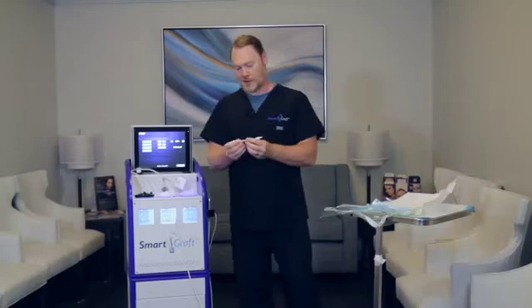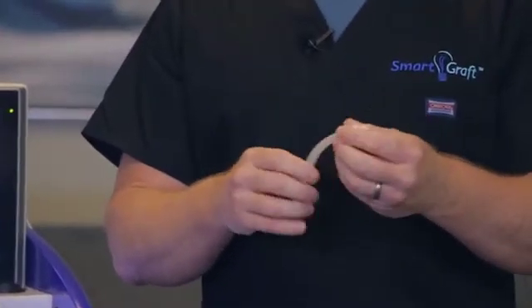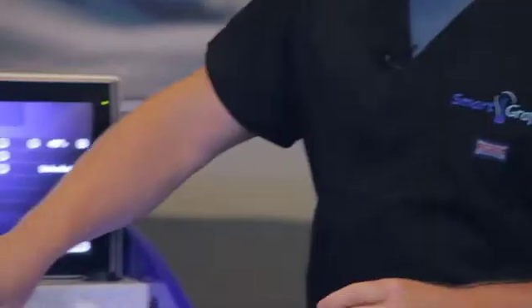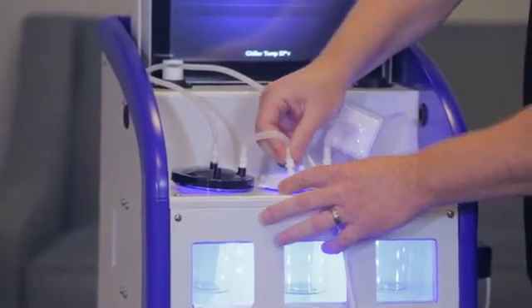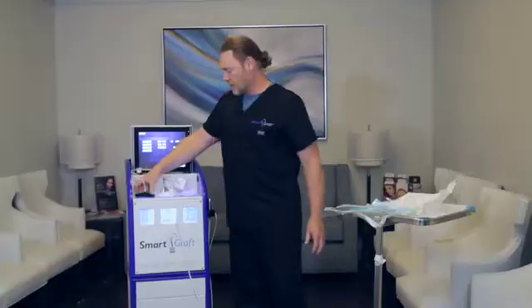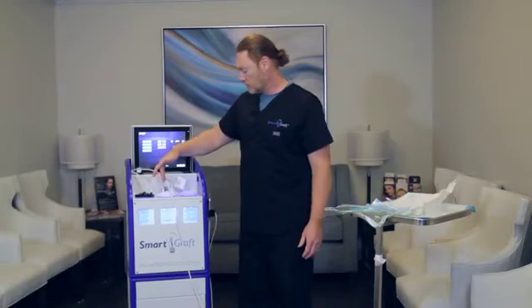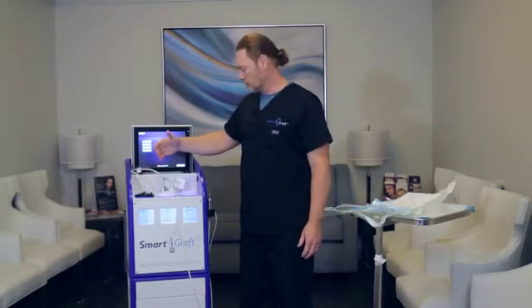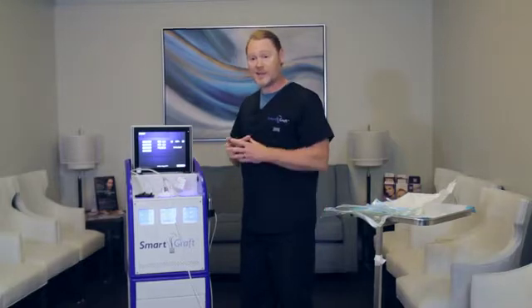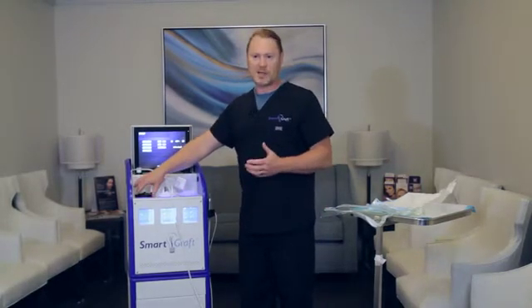The third tube actually has two different nozzles on it — they're both the same — and it's basically going from the graft canister over to the overflow canister. Each one has a function: this one is going to capture the grafts, this one is going to be the overflow saline from the misting, and this one is actually going to contain the saline itself to go over to the graft canisters to keep the grafts wet.